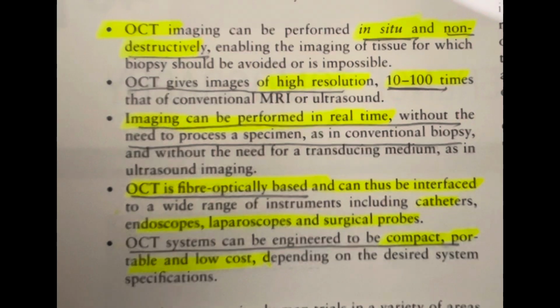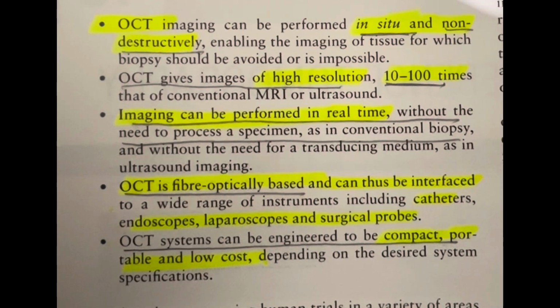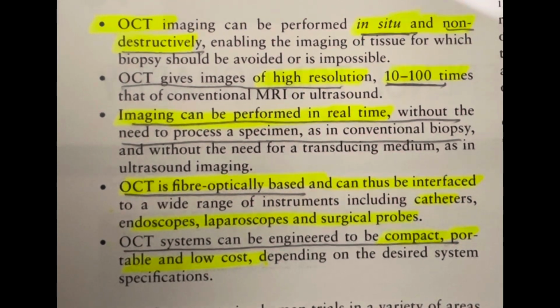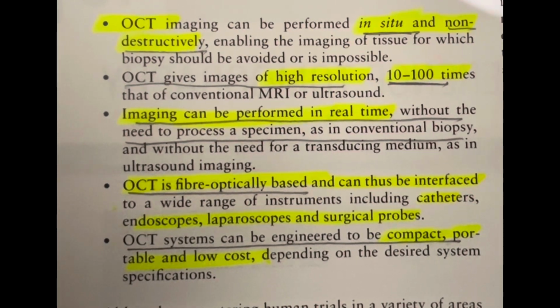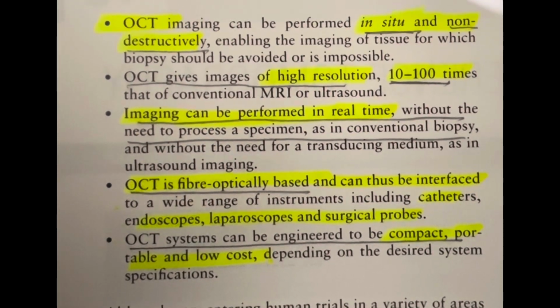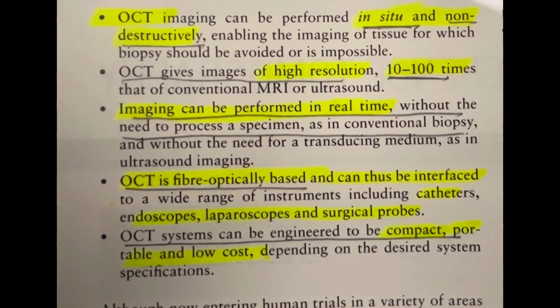Features of OCT. OCT imaging can be performed in situ and non-destructively, enabling the imaging of tissue for which biopsy should be avoided or is impossible. OCT gives imaging of high resolution, between 10 to 100 times that of conventional MRI or ultrasound.